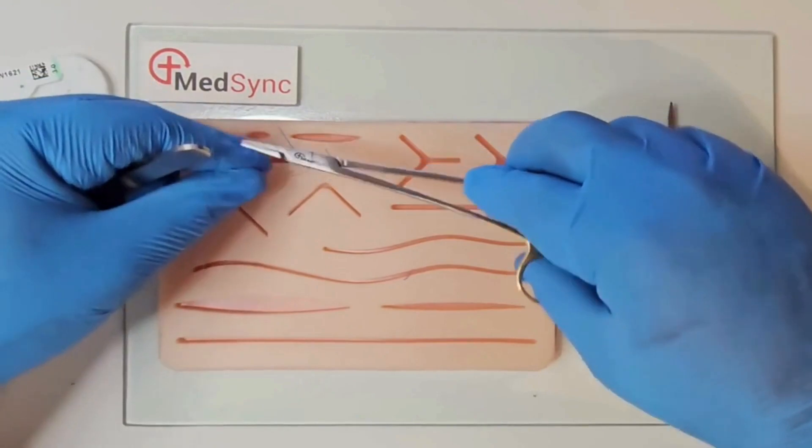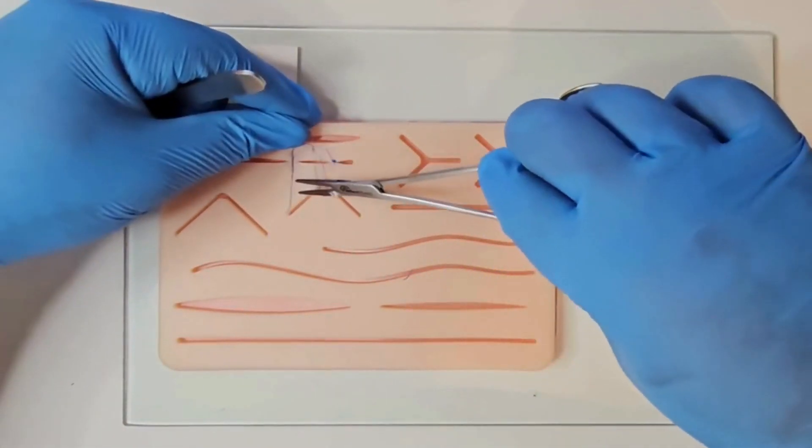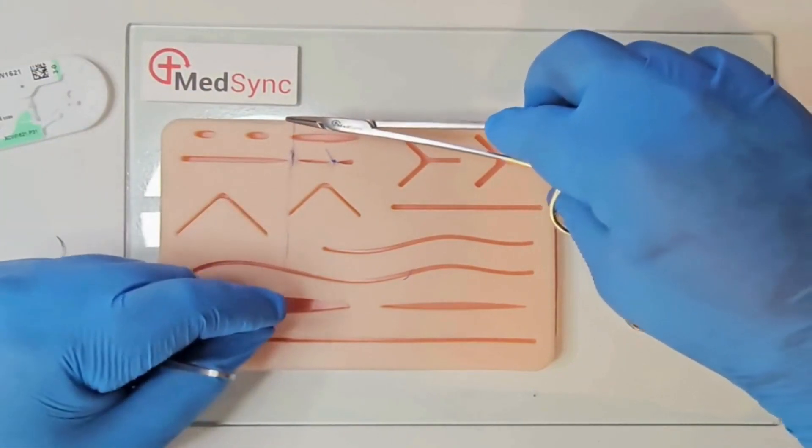Wrap the suture around the needle holder twice. Pull the short suture through. Repeat this maneuver twice more with a single revolution around the needle holder each time.